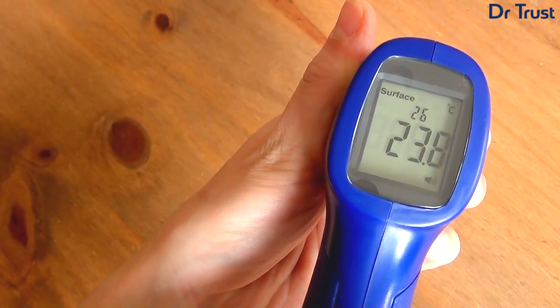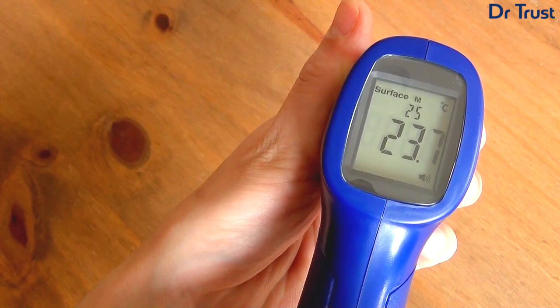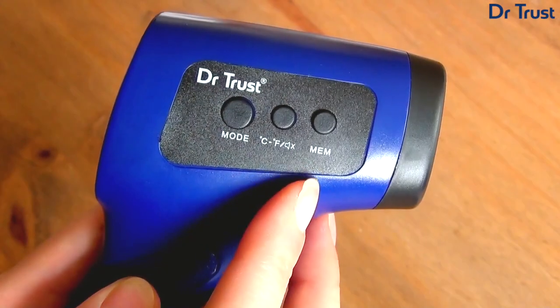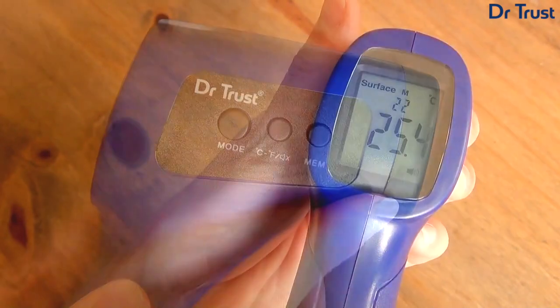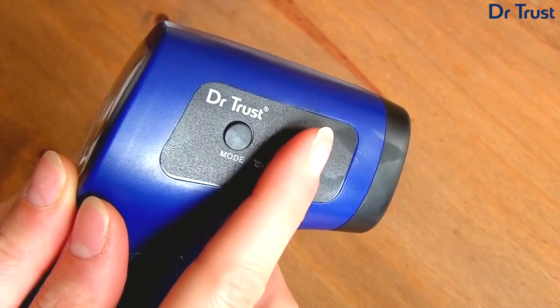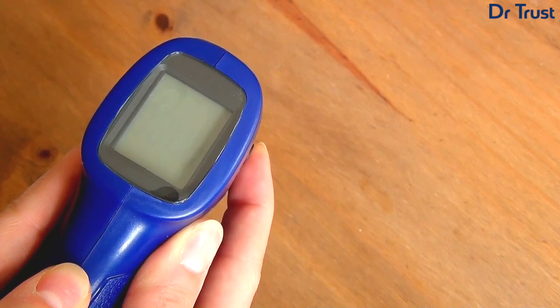This clever thermometer can hold up to 35 previous measurements in the extensive built-in memory, so you can check back on your results. To do so, simply press the MEM button. Press MEM again to cycle through your measurement memory. If you need to clear the memory, just press and hold the MEM button for 3 seconds while the device is off.